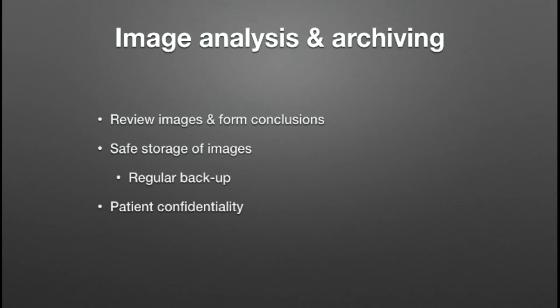There is a very important patient confidentiality issue, of course. If you are going to be storing these images on your computer, you have to make sure that the data is protected, and if you are not going to do that, that you de-identify your images. If you are transferring data in this DICOM format, sometimes these images can have patients' details hidden in them.